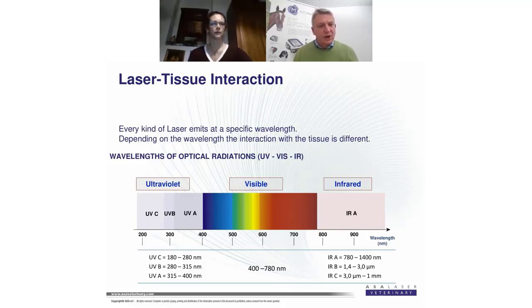We are not talking about standard sunlight goggles, but each laser needs specific goggles, because specific goggles protect for a specific wavelength of emission.